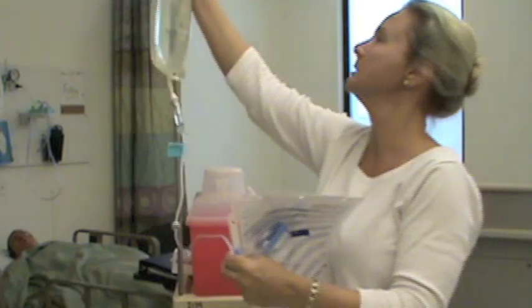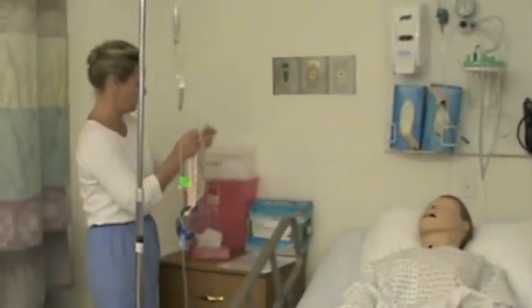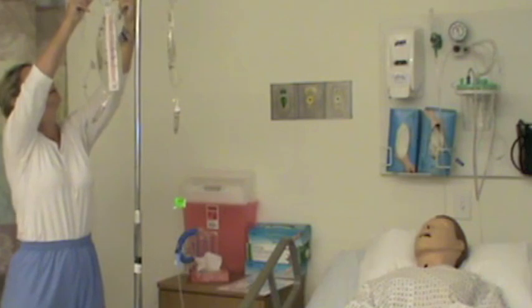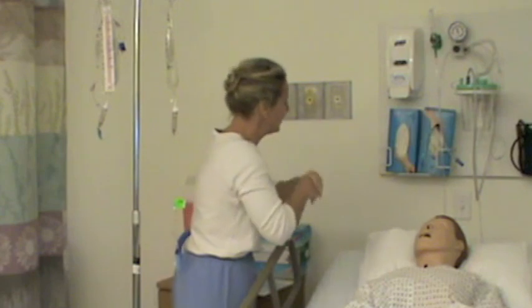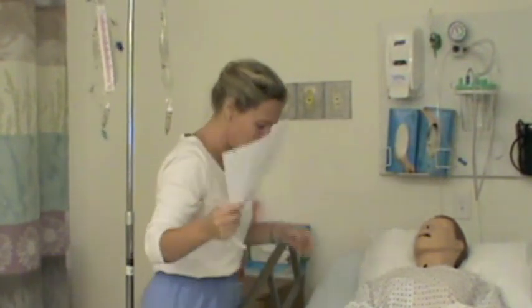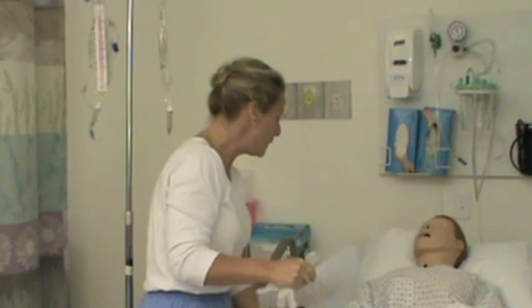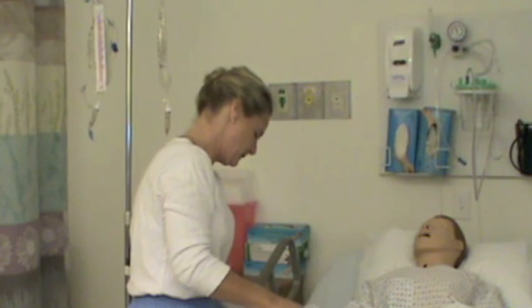I'm going to take my solution and go into the room. I also need my alcohol wipes. Good morning, Mr. Ito. I ask: can you confirm your name? Ito? Good. And your date of birth? 3-2-1950. Good. And what are you allergic to? Morphine. Okay. Let me check your medical record number. Very good.